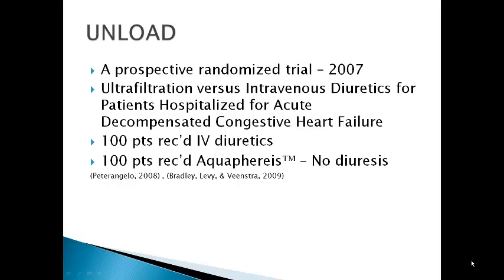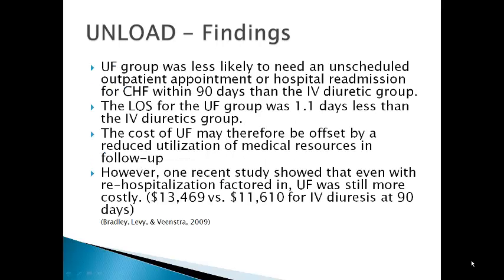This study showed 100 patients that received IV diuretics for CHF treatment versus another 100 patients that received aquapheresis treatments and no IV diuresis. The findings were that the UF group was less likely to need an unscheduled outpatient appointment or hospital readmission for CHF within 90 days, less than the IV diuretic group.